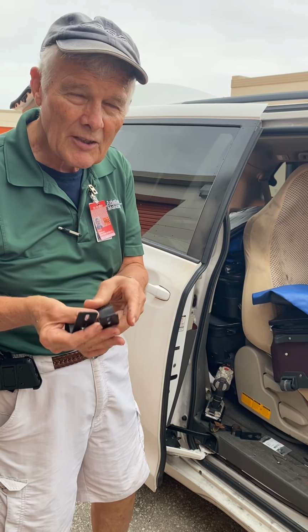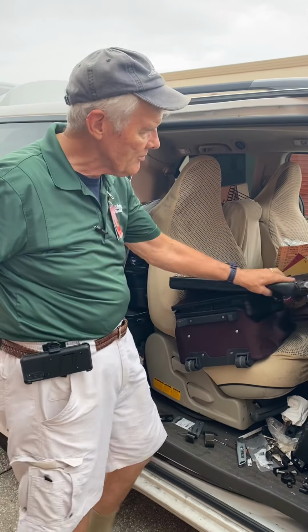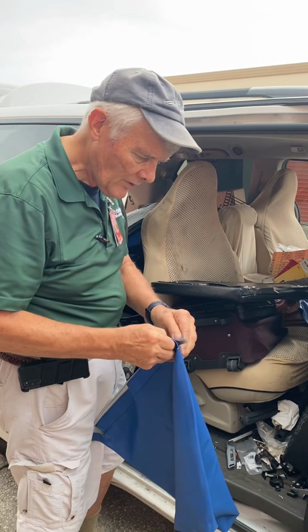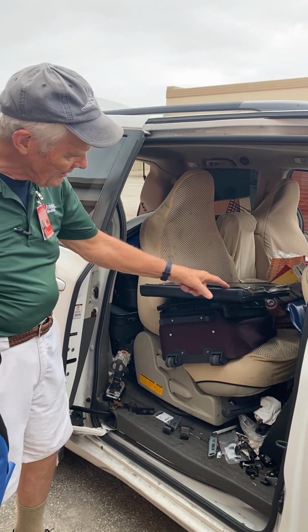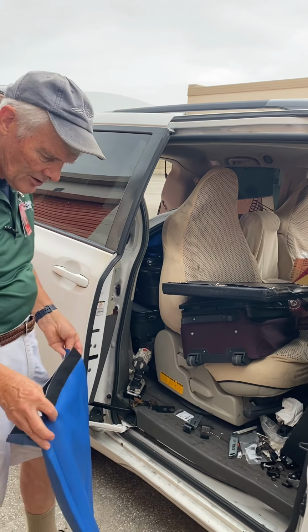I have already taken off the clamps that hold the seat to the chair and replaced the screws on top of the black seat. The reason to do that is because I'm going to use the screws as a guide for when I cut some important holes that I need. I always put the seat towards me, the crease on the seat, which would be the back of the seat as you look at the chair.